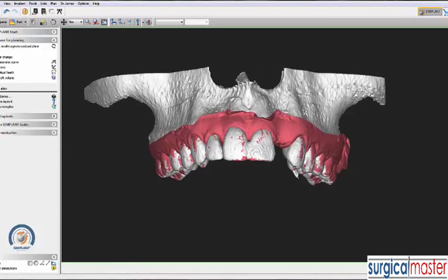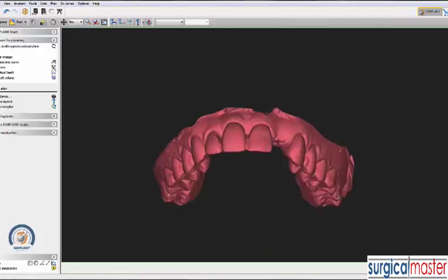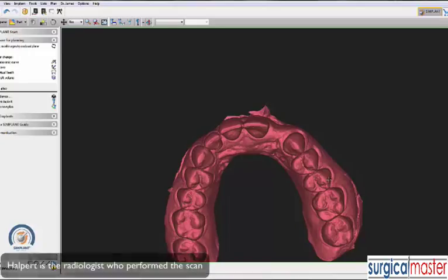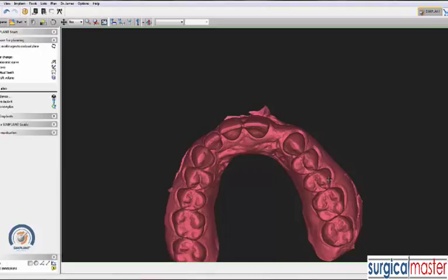What's missing here is the tooth. I didn't have enough time to merge the impression of the bonded tooth. So we're going to use a virtual wax-up to give us an idea where the tooth fits in, and then we can plan the implant accordingly. I'm not looking at Halpert's printouts, CD, or PDF files — I'm looking at the 3D and all the different sections, and I'll show you how it works.